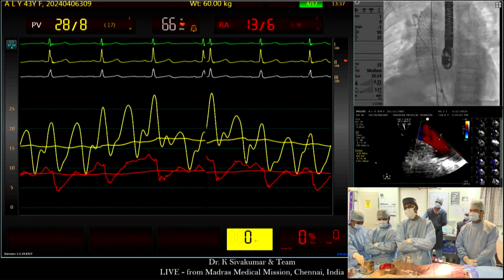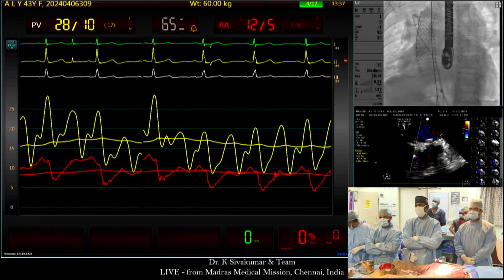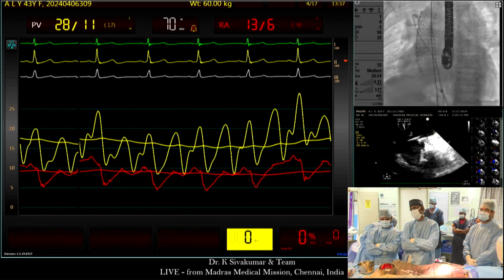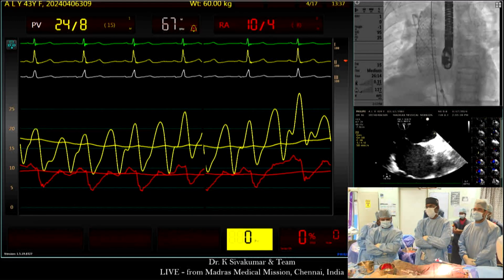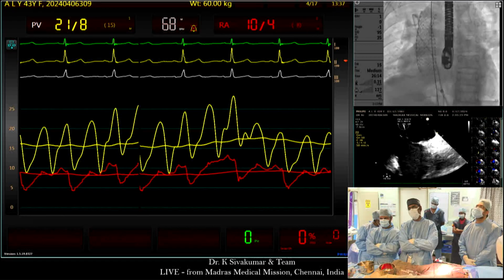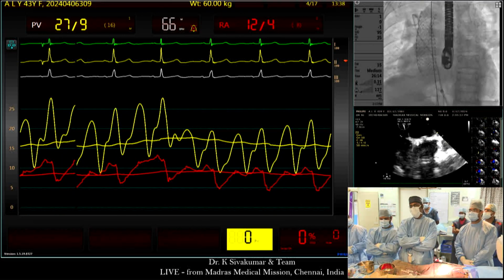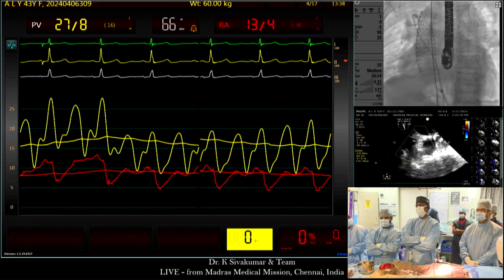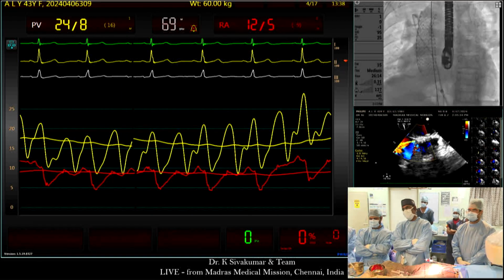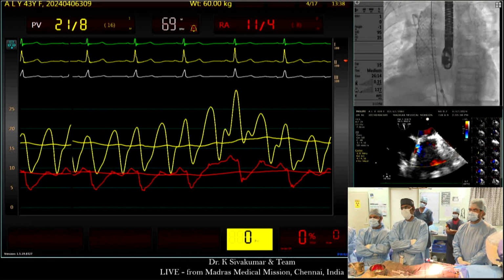Gregor, a great question. Actually, we have done about 135 till now, and we did not have a single incidence of sinus nodal problem. But in the world literature, when Eric Rosenthal collected all the data, there was one patient who developed significant sinus bradycardia and subsequently needed an atrial pacemaker. Having said that, the course of the sinus nodal artery in the superior cavo-atrial junction is epicardial. So by giving a pressure from inside, an epicardial artery will not be injured a lot.